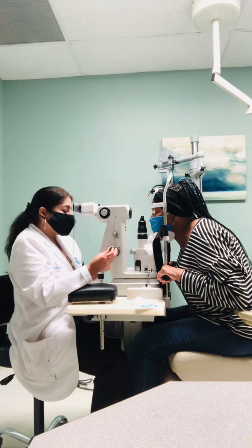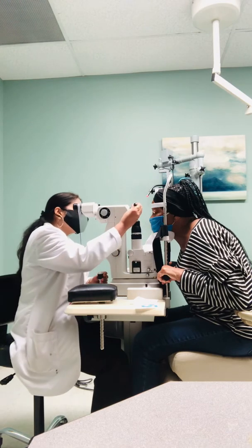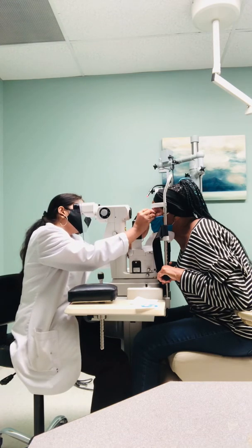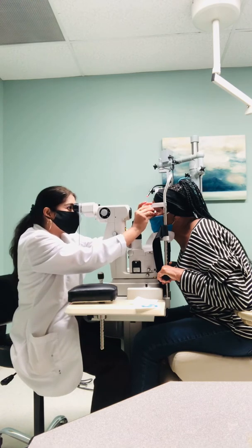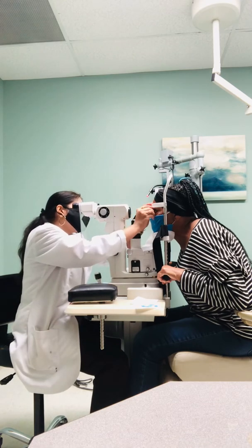I already did one eye before, so I'm doing the second eye now. Her eye is numb, and you can see that this procedure is very effective because her pressure has been better since we put her on the drop.